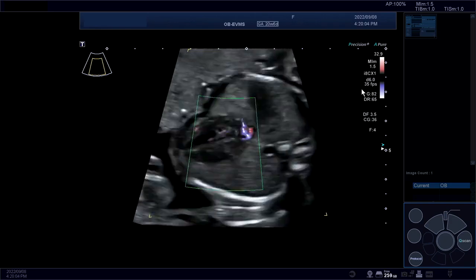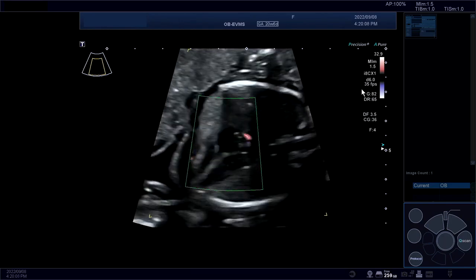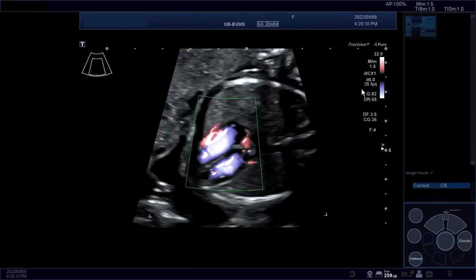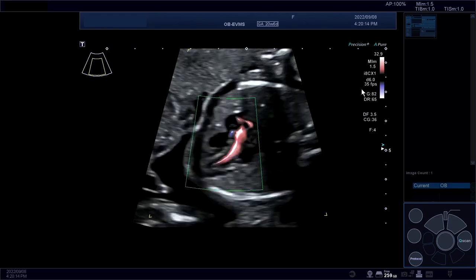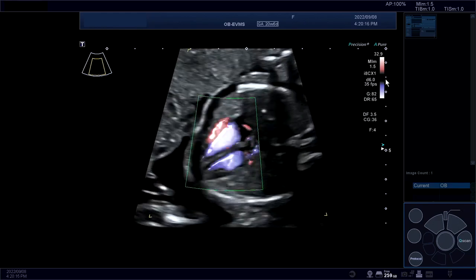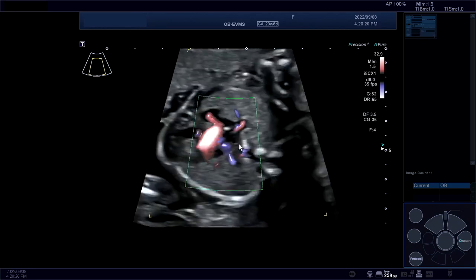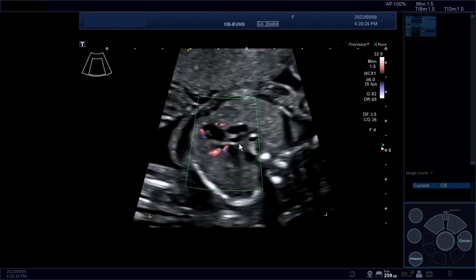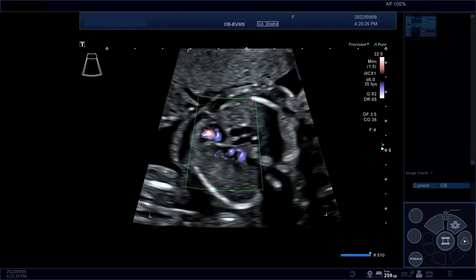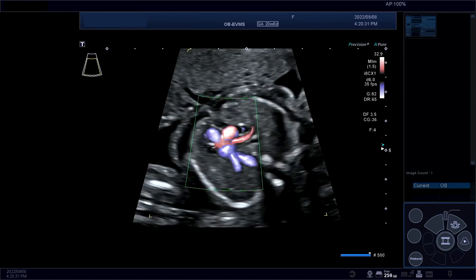Let me go back to remember the ribs, so I'm going to go back to one full rib on either side, and I'm going to go to the 4-chamber view here with color, and you can see the LVOT is coming up a little bit here. Now I'm going to go into the views we talked about. So I'm going to come from the abdomen and angle down. So here you see on color Doppler, if I cine loop back, you see the pulmonary artery and its division.